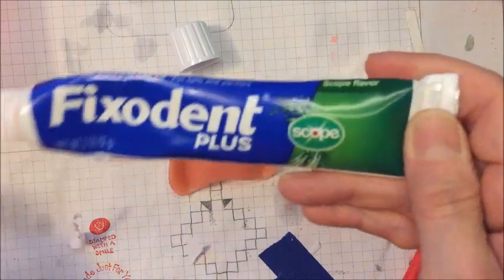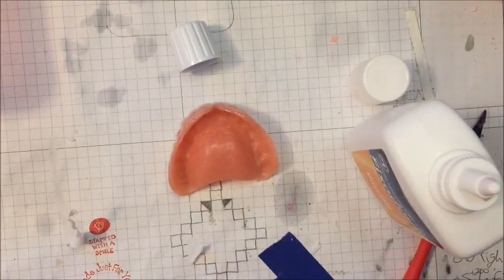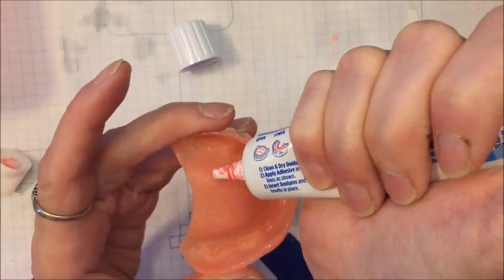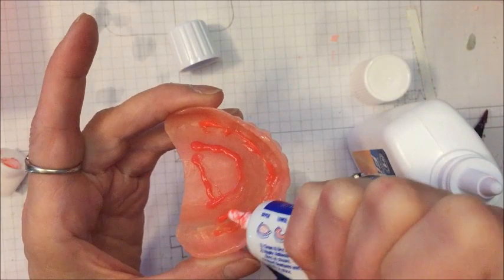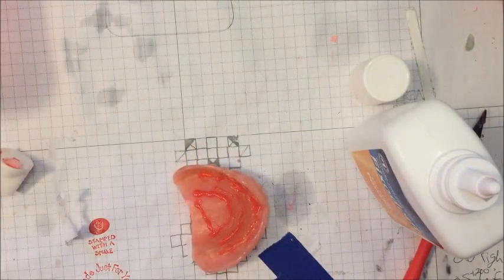Now for the top denture, I use Fixodent Plus with Scope. Next time I get this, I'm going to get the non-Scope kind — they do have that. For my top denture, I basically put the glue on almost exactly like the picture shows. This has a precision tip, so I make a line here and a line there, then go around, and then a little bit on top. I don't put any powder on my top denture. I put them in, then push, pull on my lip, and bite down a couple times. And my teeth are in for the day.